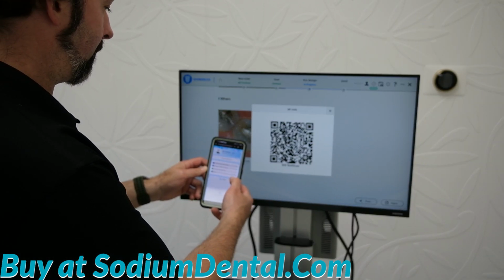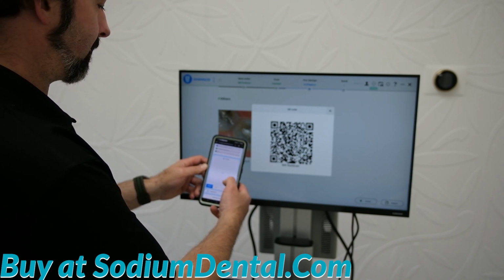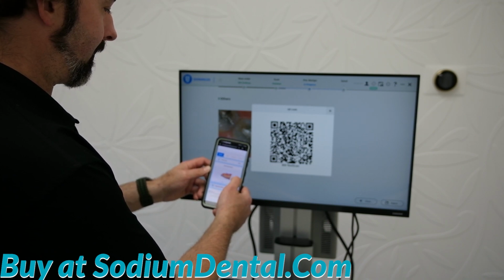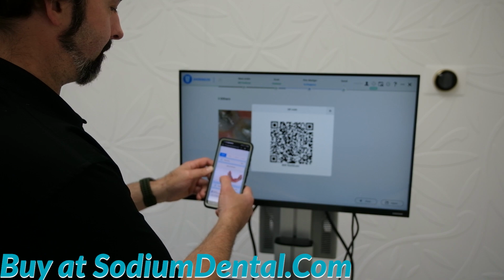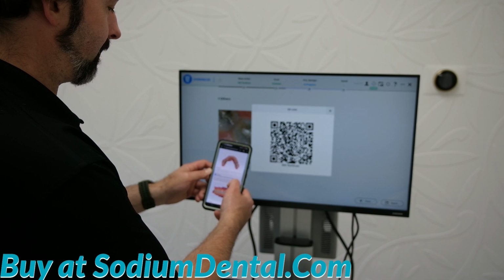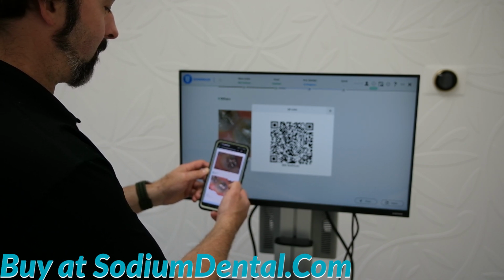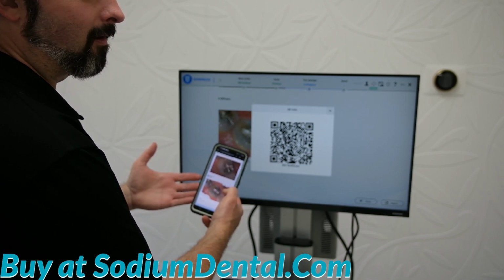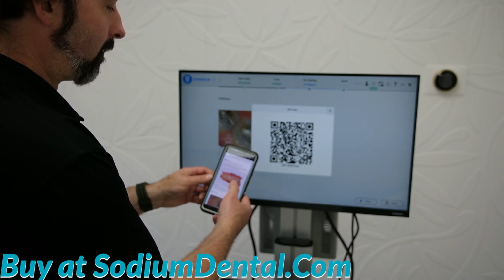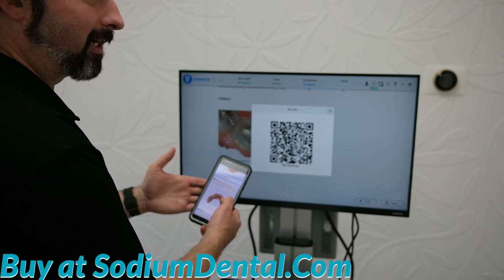Your patients will get a screen like this, where the dental model will load in the center area. Your screenshots taken will be available to them, as well as your notes that you entered into the oral health report that you would like them to think on or possibly take home to discuss with family or friends. And this is a great tool for reminding people to get care that potentially they've been putting off.